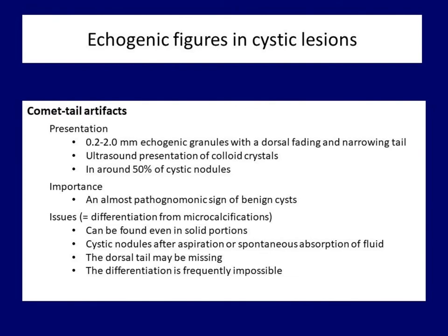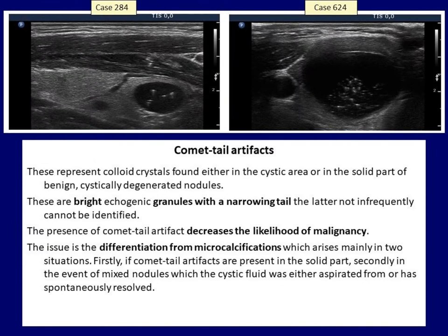In the next part of the topic, I will discuss two intranodular echogenic figures related to cystic degeneration. You can pause the video to read the description. Typical comet tail artifacts are presented in these images. These colloid crystals are usually found in the cystic part of benign nodules. These bright granules have a dorsal narrowing tail; however, the tail is lacking in almost half of cases.